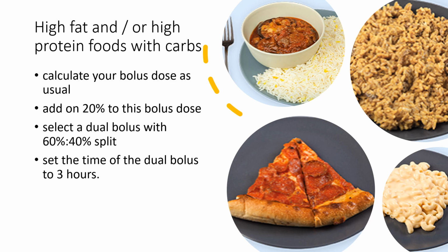You'd then need to focus on the bolus extension. The bolus extension may need to be more or less than 3 hours. If the postprandial rise is too great, perhaps 60 to 90 minutes post-meal, shorten the extension time. If glucose is above target after the bolus extension, the extension may need to be longer. Carmel Smart's work suggests that very long bolus extensions are rarely required, and that often the bolus extension needs to be shortened to 2 hours.